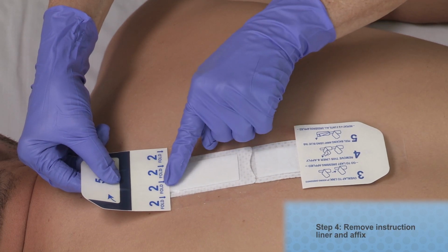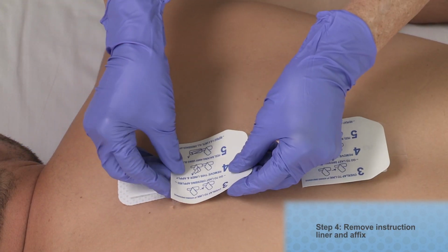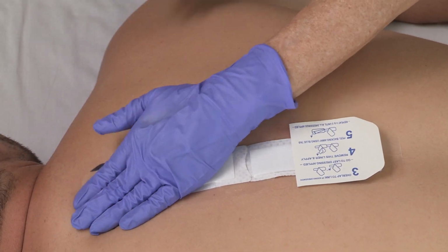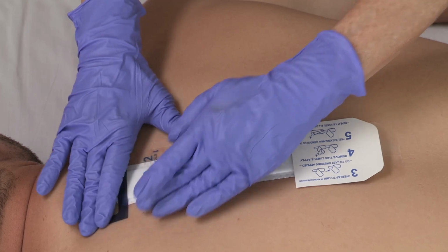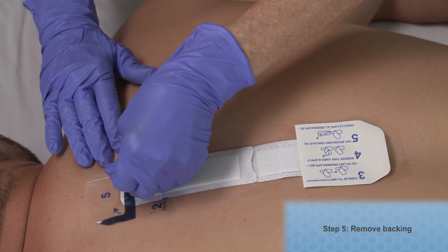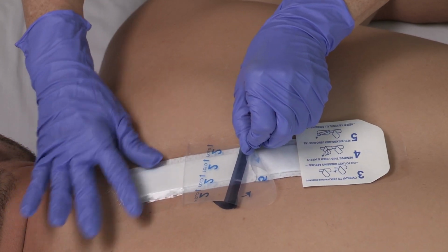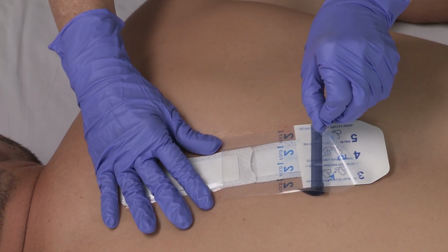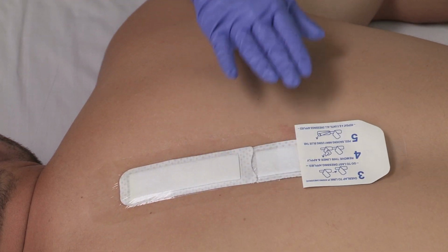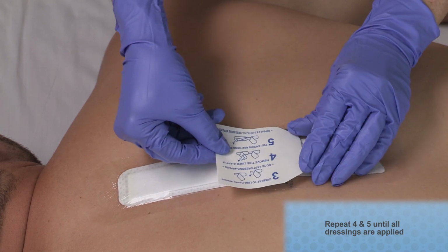Starting with the last Procellera FlexEFit dressing applied first, remove the instruction liner and affix adhesive to the skin. Pull either blue tab back at an angle to remove the backing. Gently press adhesive down. Repeat steps 4 and 5 until all dressings are fully applied.